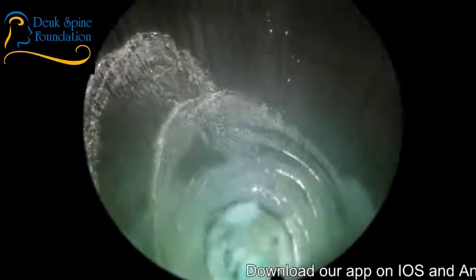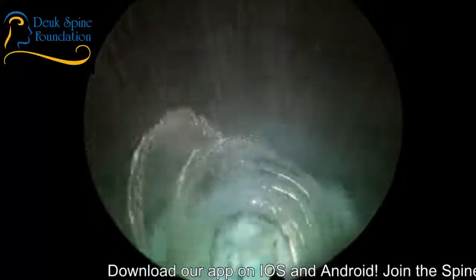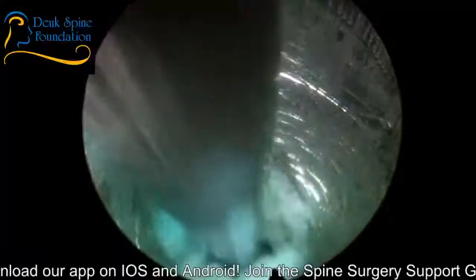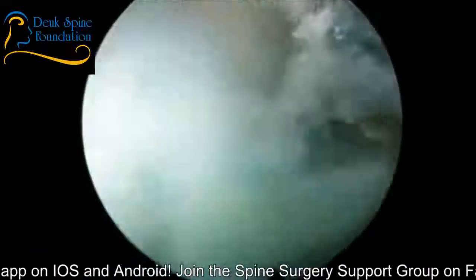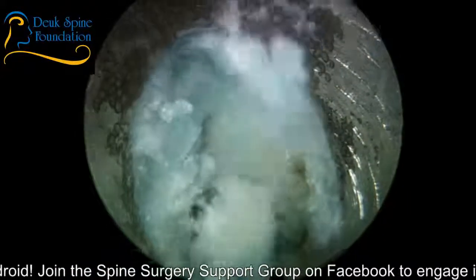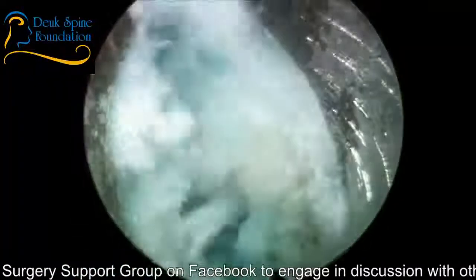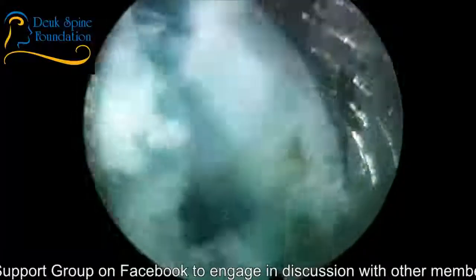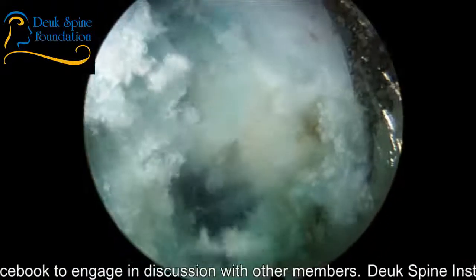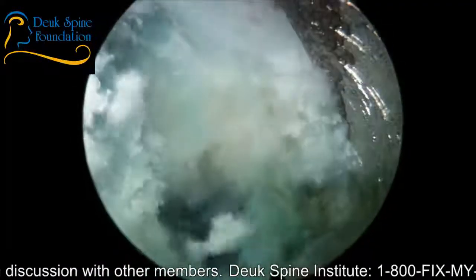That's something that Dr. Anthony Young taught me. A lot of people who do endoscopic surgery don't know that. Dr. Young and I remain friends, and his son Chris is also a spine surgeon. Come on, Luis, teach him the right way to do this, please. It's a pinch and pull, it's not a Greco-Roman wrestling match.